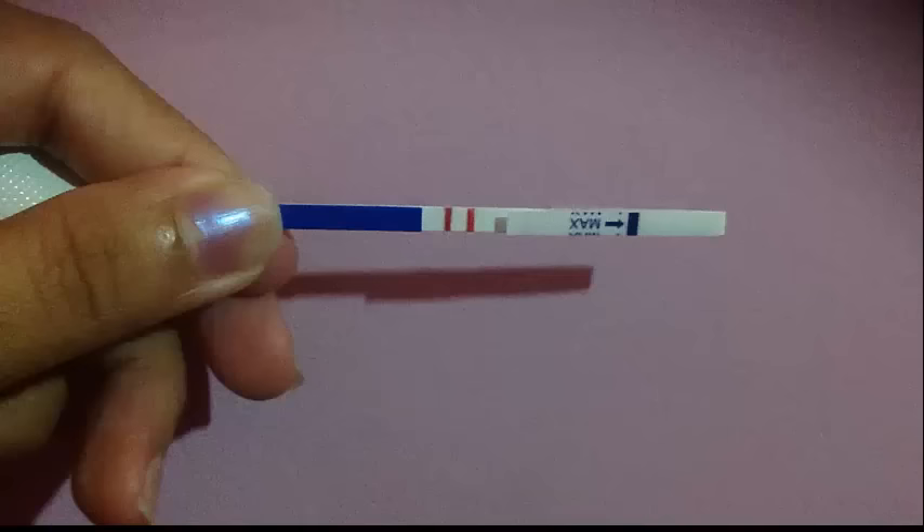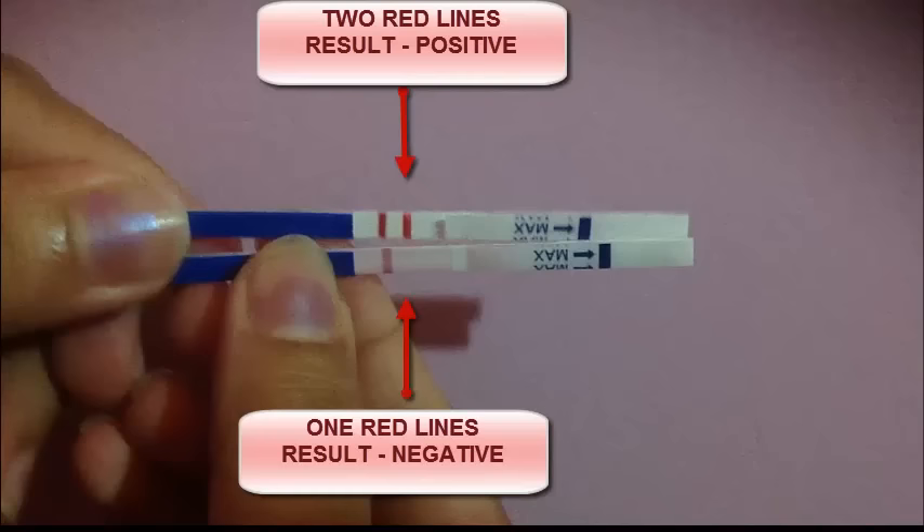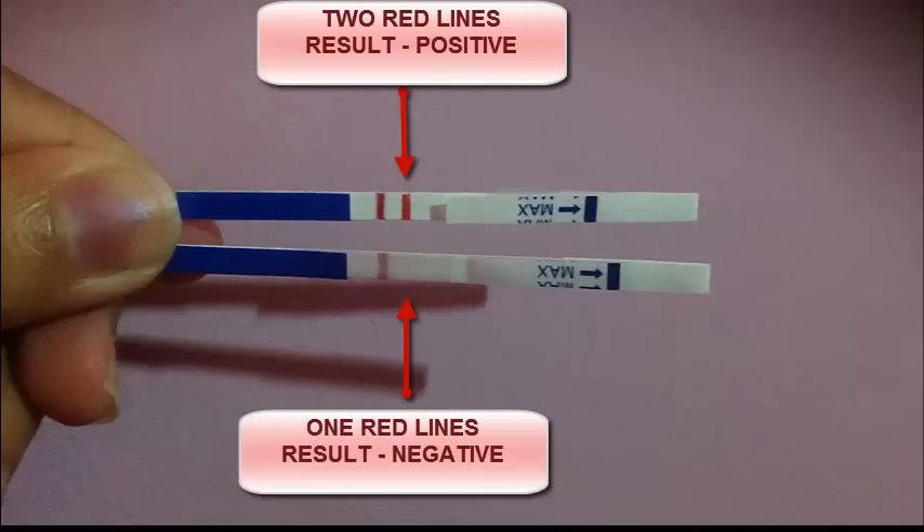That's the results. The two red lines mean the result is positive — that means you are pregnant. If it is one red line, that means it is negative — that means you are not pregnant. That's all, this is a very simple thing you can do by yourselves.